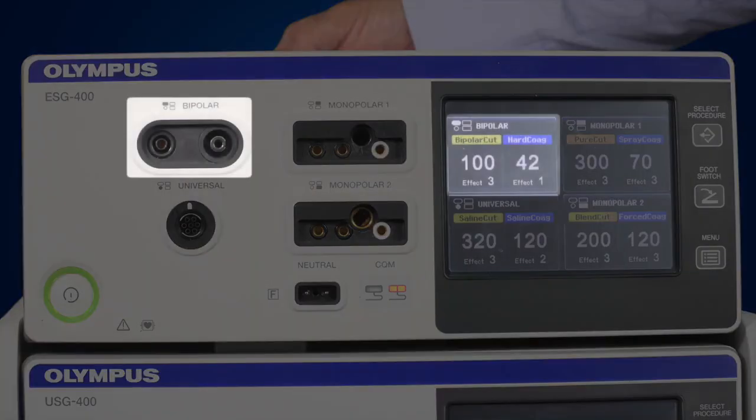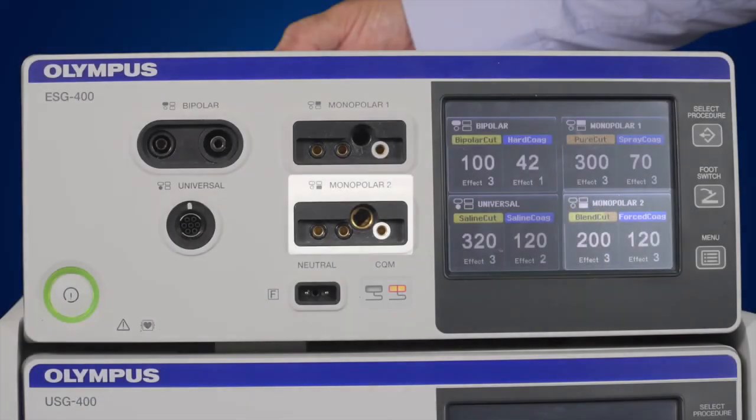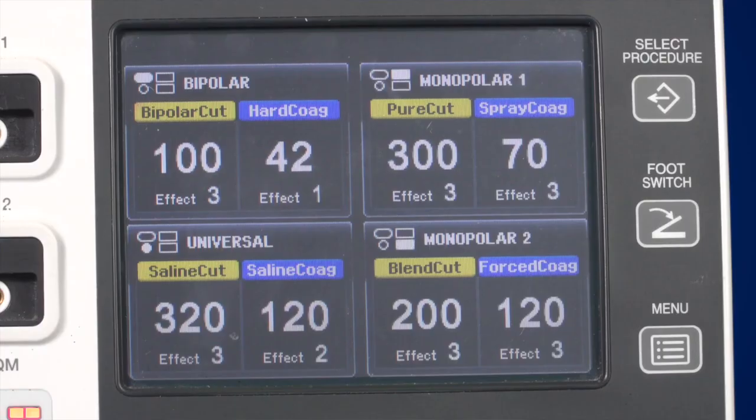The display quadrants correspond to the connection areas on the left of the generator. Each time the generator restarts, it activates the settings which were in use when it was shut down. The graphical user interface has three different display layers. The first layer, or all screens, shows all connector settings and allows you to change the settings.